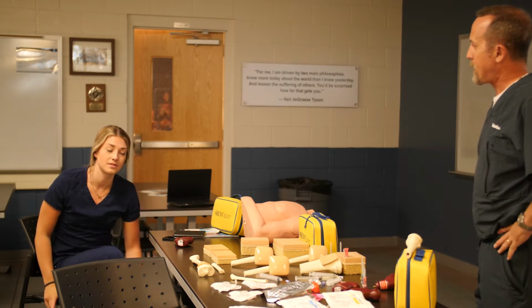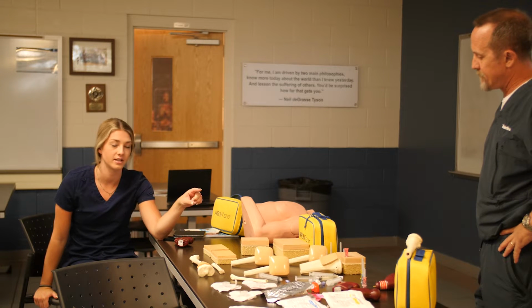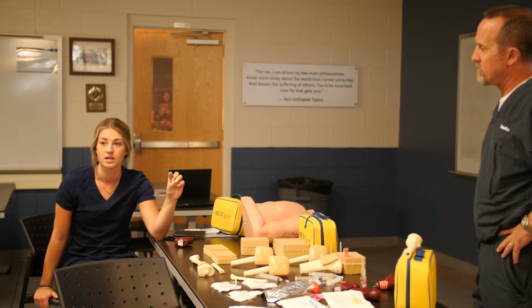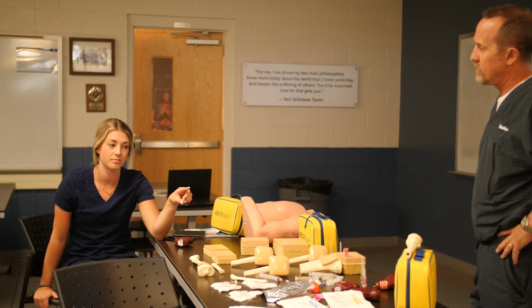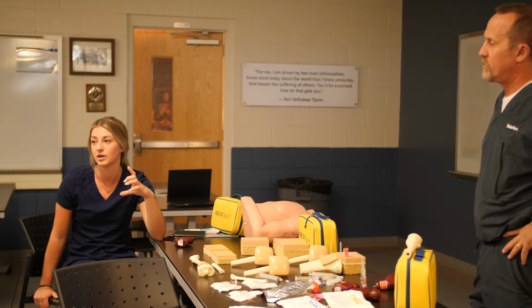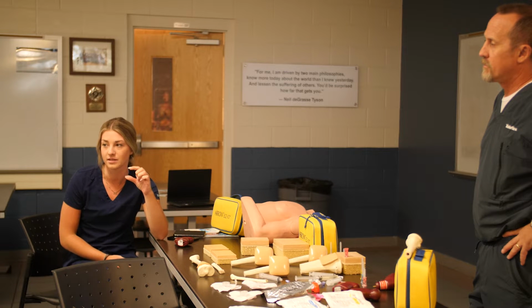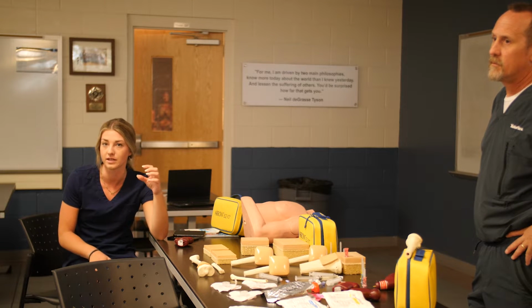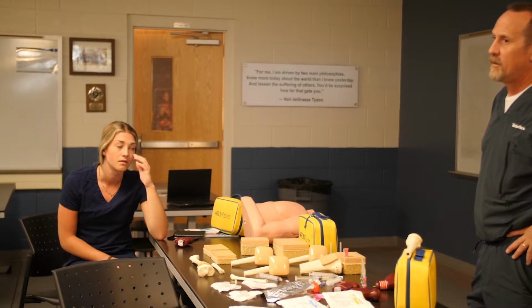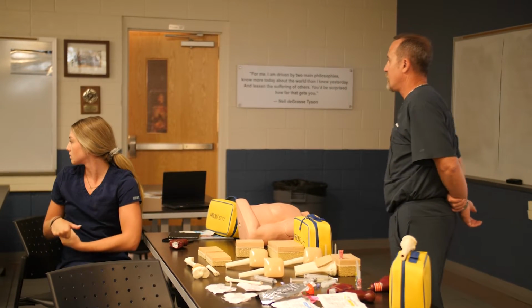Okay. Something with the needles as well, with Chris touching on the black lines always having to show with those weight ranges, is the blue needle can be used on pediatric patients as well. If you have a tiny baby that has chubby entire legs, sometimes that pink needle is not going to be long enough to make it through the extra tissue. Let's say you have a 6-month-old, they've got those fat little legs.